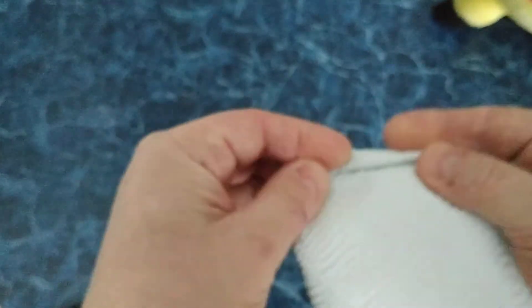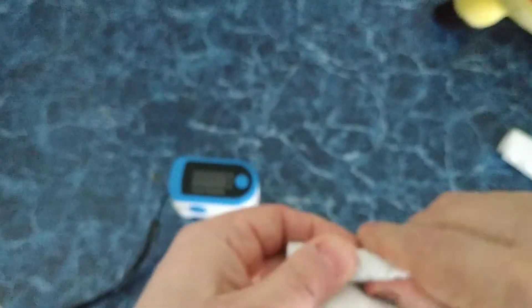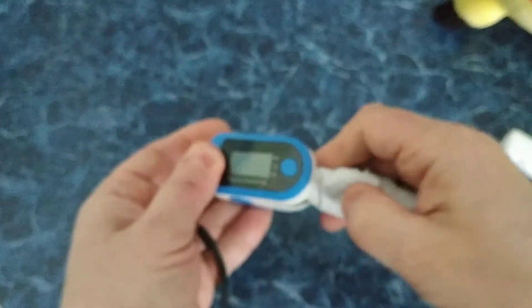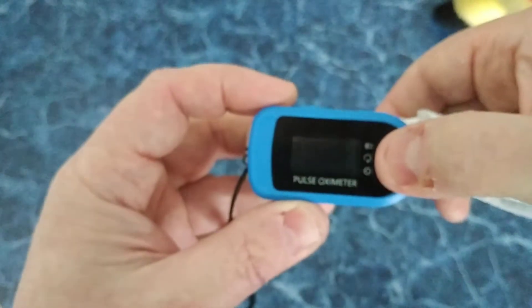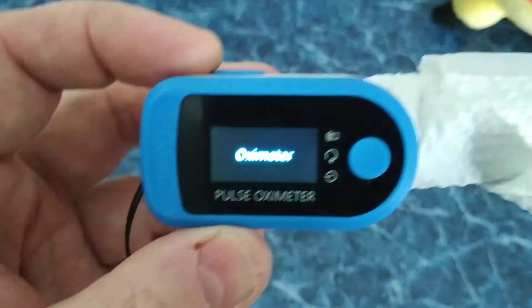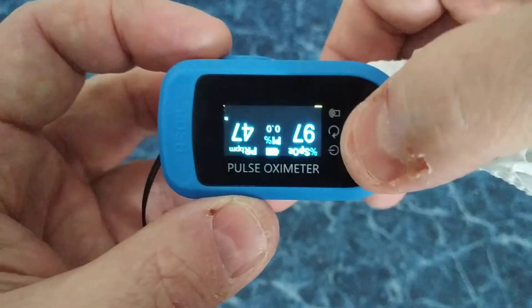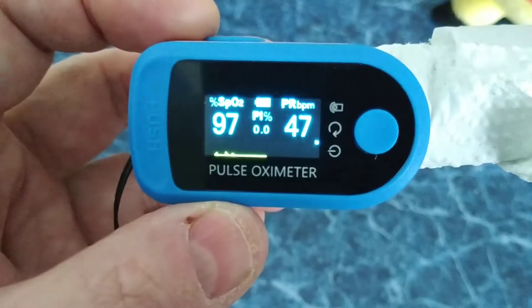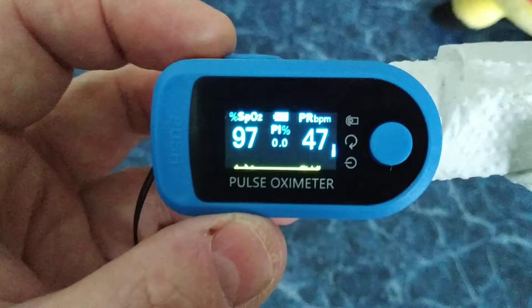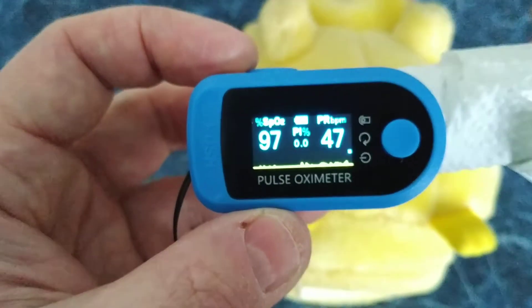Let's try maybe this kitchen towel paper. Let's also roll it like a finger, put it inside, and press this magic button. We also see the oximeter reading — 97%, and a heart rate of 47. So it's not as alive as my friend Pikachu, but it's also alive.